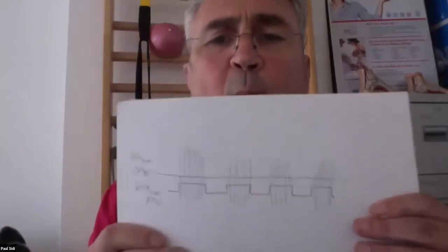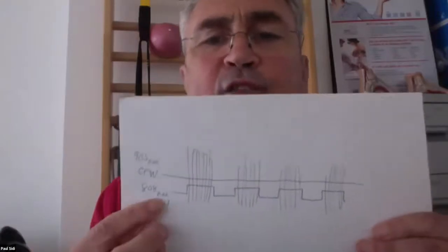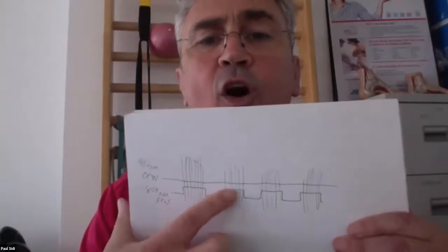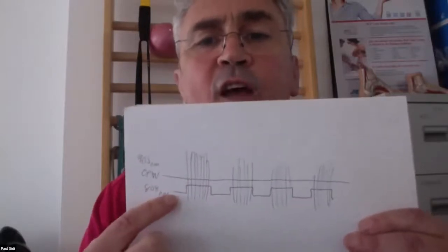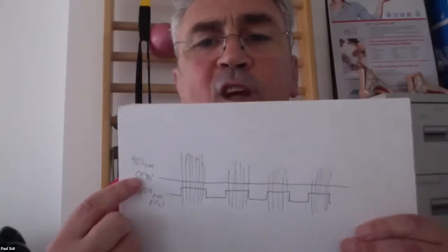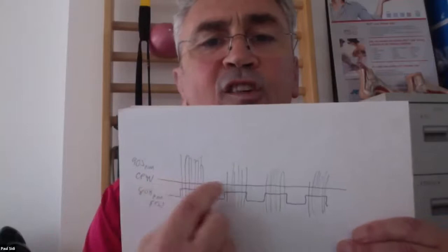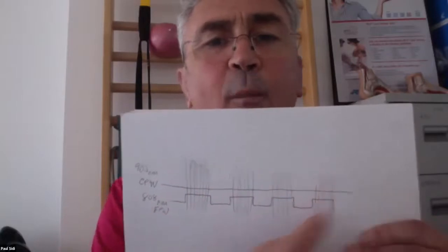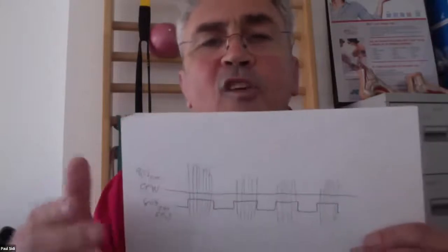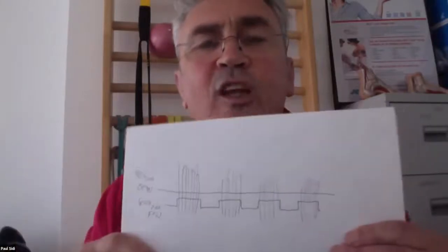What happens is when we press that CPW, this frequency wave, where it's frequency on for whatever time it is and on, is no longer frequency. As you saw, the frequency box disappears. When you press the CPW, it becomes totally continuous. It's on all the time. And then this is going through all the time. So what happens is just by pressing that button, you literally double the joules straight away up to, as you see, it just doubles it.